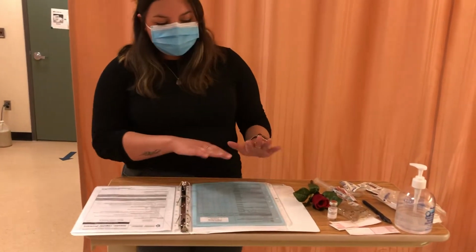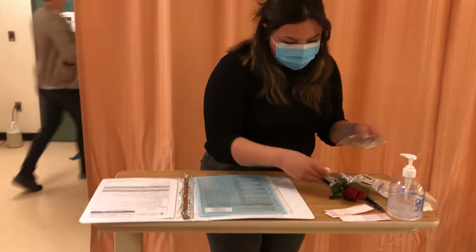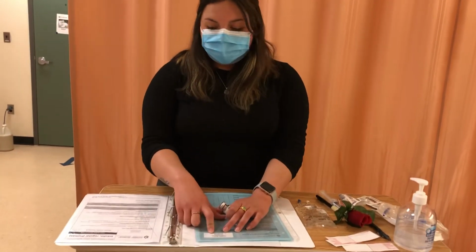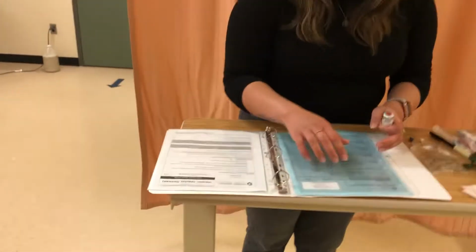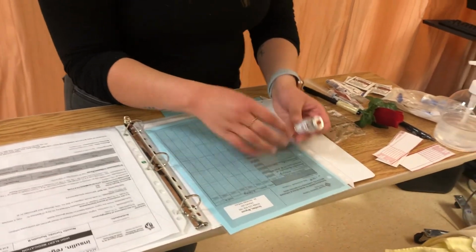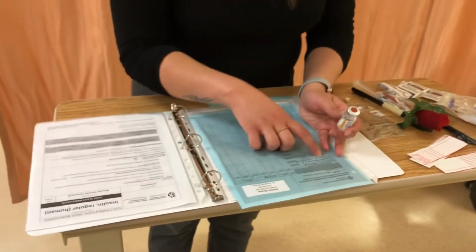So I'm going to start by doing my first check with my drug, my diluent, my MAR, and my PDM. So this is Bryson, Scotland. I've already confirmed that I have the correct patient with the physician's orders. No known allergies. So with the right drug, we have Insulin R. This is Insulin R, and this is Insulin R. This is to be given continuous IV.